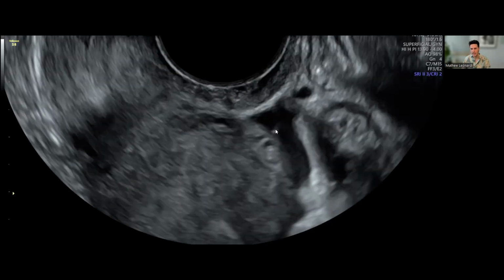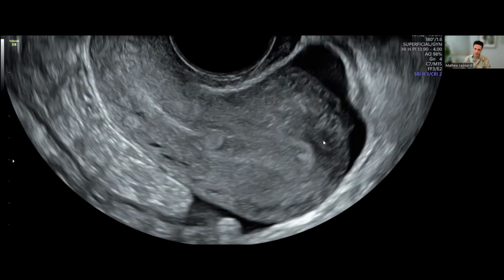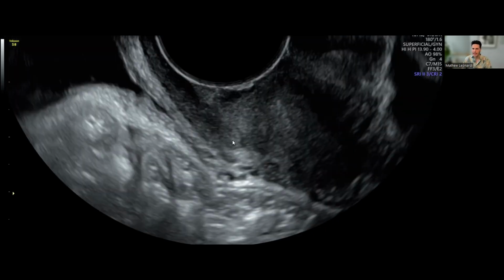There on the back of the uterus is that area again that I raised earlier. That's a better depiction of it. Still a bit of motion artifact in this image, but not too bad. Not sure why I captured this, maybe because the polyp showed itself really nicely again. Other than that, I can't really see a whole lot in this picture. You can see the bowel and the periphery kind of coming around and then capturing it again there. And then I move on to the anterior compartment to complete the assessment.